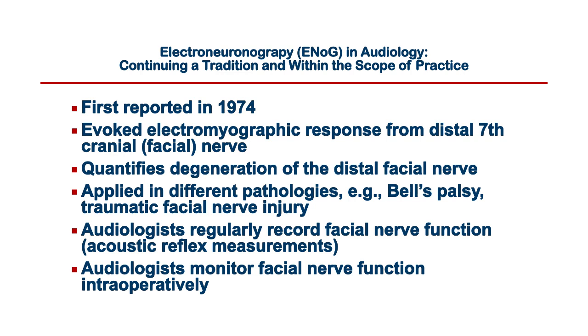suddenly became experts. And no audiologists had been doing it. I'd never learned about it in my training, even in my PhD program. So we all became self-taught experts on ENoG and started to not only use it in the clinic, but also give lectures and workshops so that other audiologists could get up to speed. And that's actually what Doug Beck and I have done at a few AAA conventions. We've given 1 hour courses to get people up and running on this. So if you end up in a medical center, if you end up working with an otologist or neurotologist, you may very well be asked to perform ENoG.